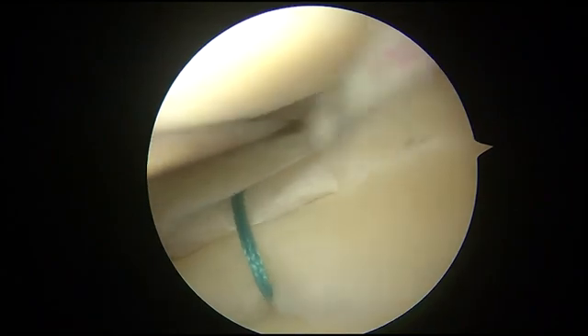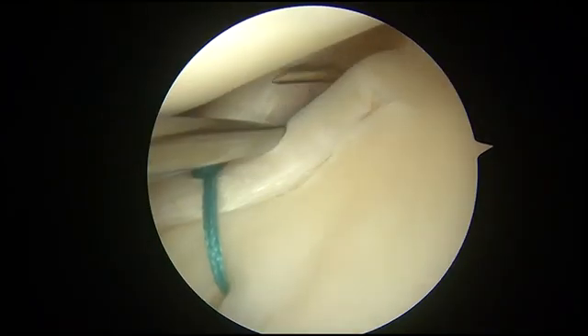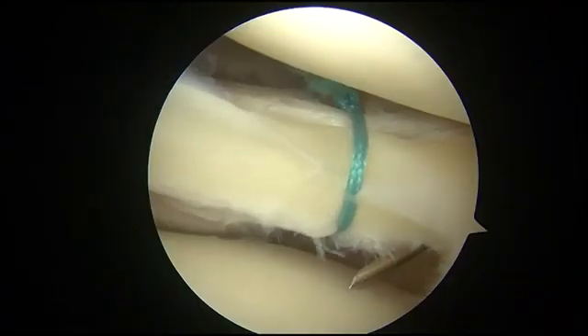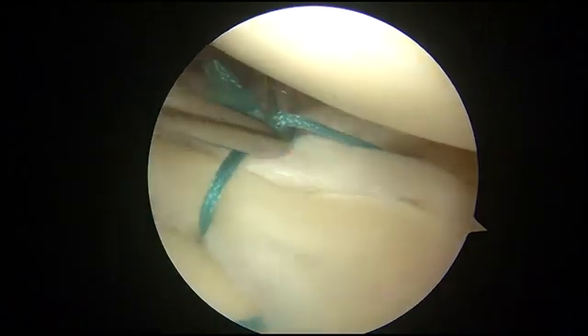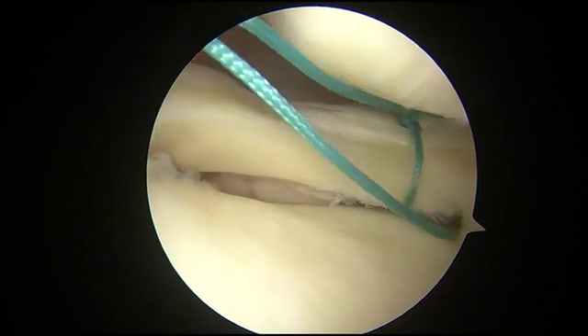This video introduces a single needle, or inside repair technique, for tears of the lateral meniscus at the popliteal hiatus area. This technique is suitable for horizontal or longitudinal tears at the red or red-white area. The supine position of the patient and figure-4 position of the knee is suitable for this technique.